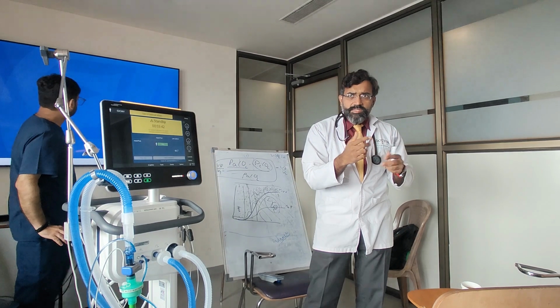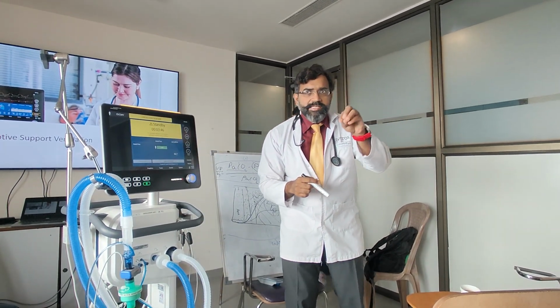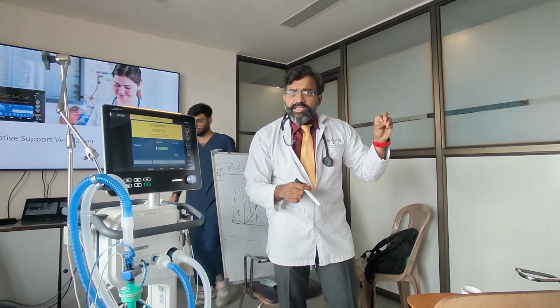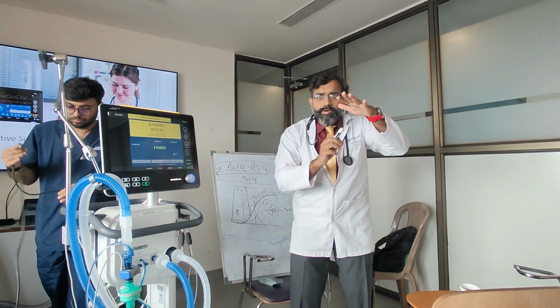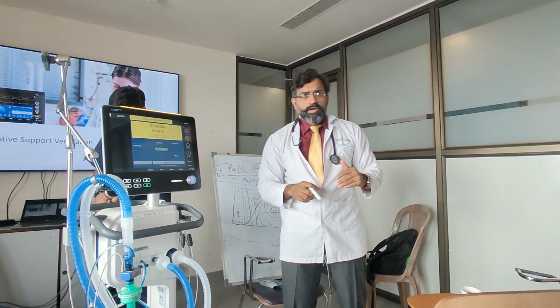And there are knowledge-based systems, which are other closed-loop systems. What are knowledge-based systems? It will look at a parameter and change the ventilator. For example, our Evita XL. We have a machine called Evita XL in our ICU. The Evita XL has a carbon dioxide sensor. You put that on the patient, and as per the carbon dioxide, the machine changes the parameters, the tidal volume and the respiration.